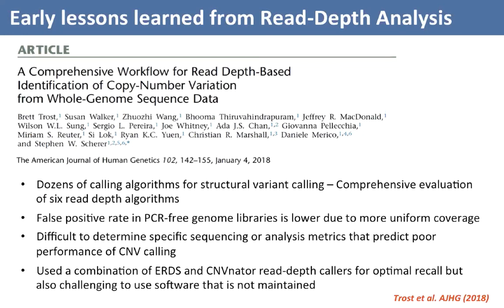Some of the lessons that we learned: PCR-free genome libraries are what's needed for CNVs, because they have a much lower false positive rate than PCR libraries. The other thing we learned is that it was very difficult to determine a specific sequencing or analysis metric that predicts very poor performance in CNV calling. There are metrics you can use where you know the CNV analysis isn't going to work, but it doesn't always correlate well with what your final result is going to be.